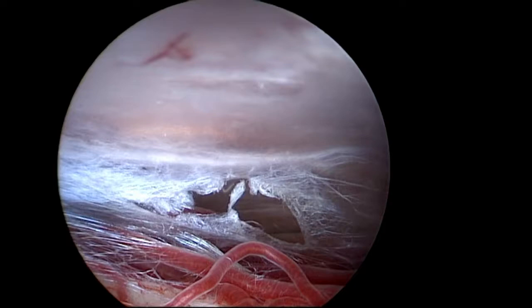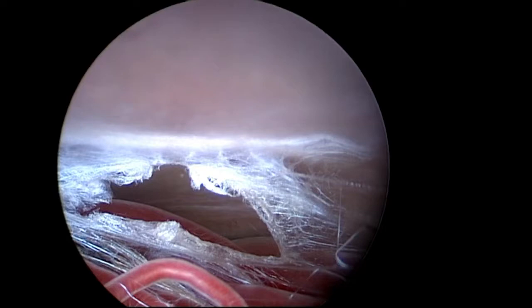The final inspection with the zero-degree diagnostic scope shows the wide fenestration of the floor as well as of the arachnoid membrane in the prepontine space. The good pulsations of the floor are a favourable prognostic factor.